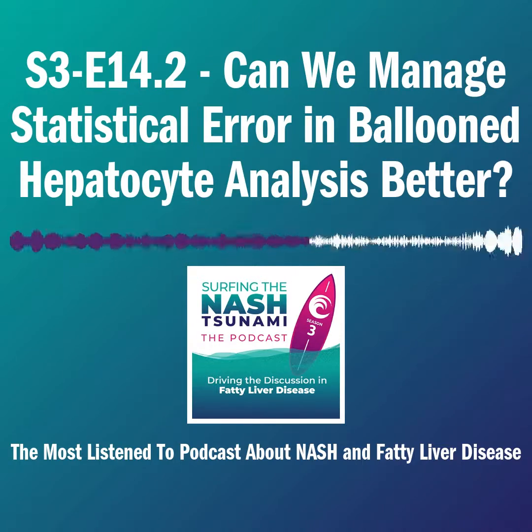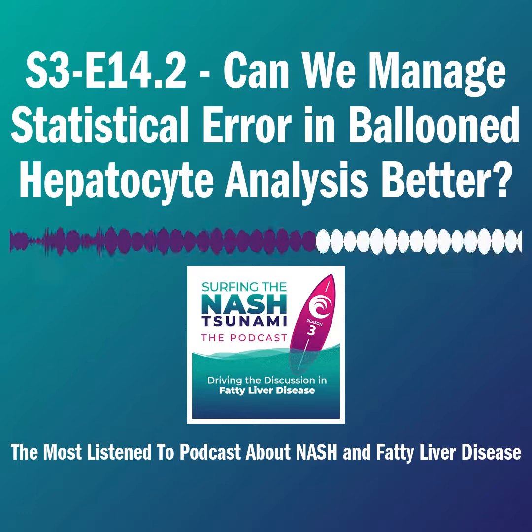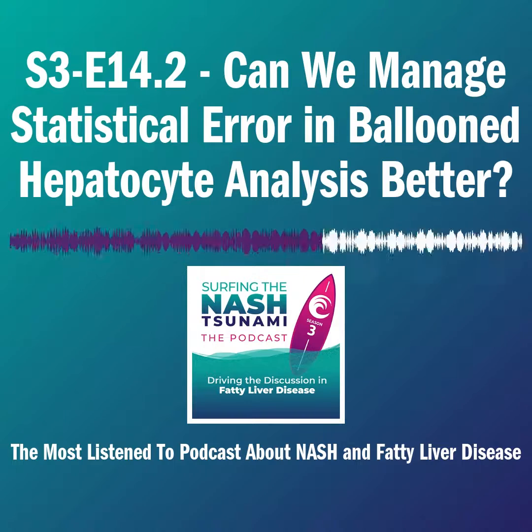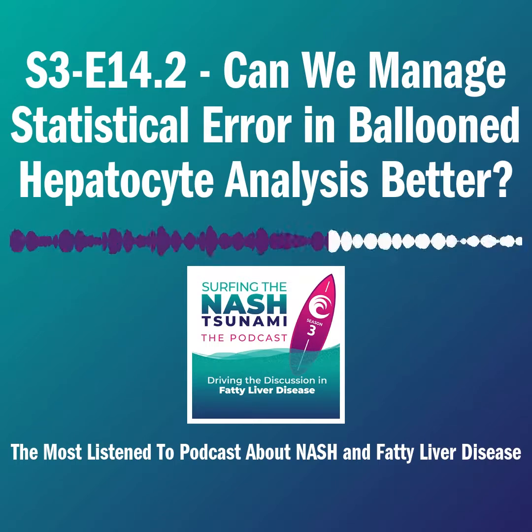But in terms of the specific stain, the problem is there isn't. There have been a number of things proposed, like sonic hedgehog, for example, which potentially are helpful in detecting balloon cells, but there isn't a ground truth. There isn't one thing that if you stain it with this, the balloon cells all light up, guaranteed. Because otherwise we'd use it and there would be no need for everything we're doing here. That's one of the problems. Yes, there are a whole number of different stains that might help, but where do you draw the line with them? And as yet, we don't know if they're responsive to therapy or anything else. So it becomes more difficult.